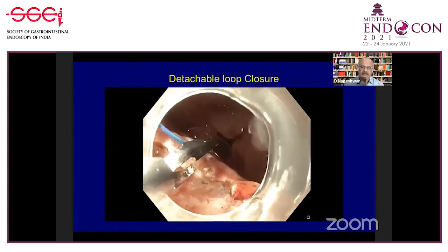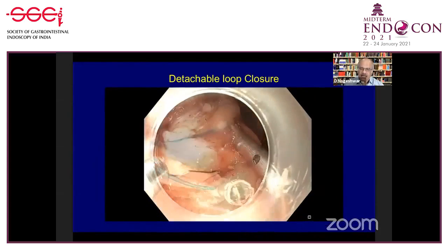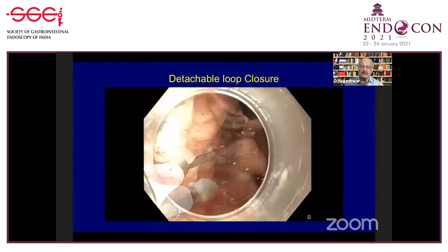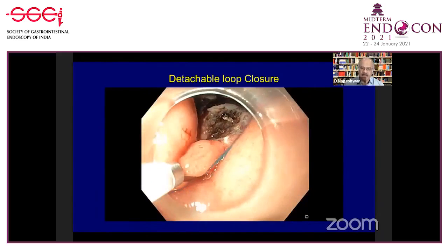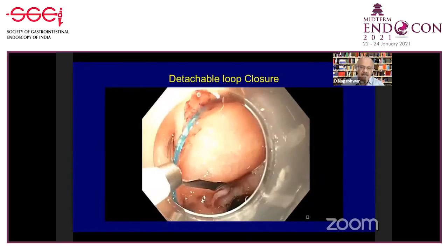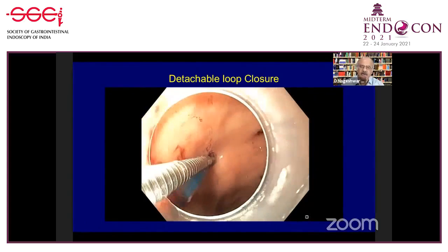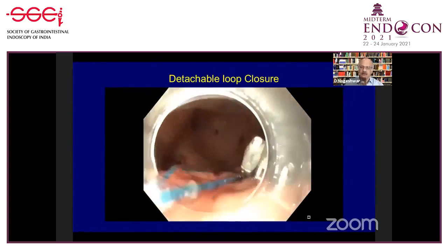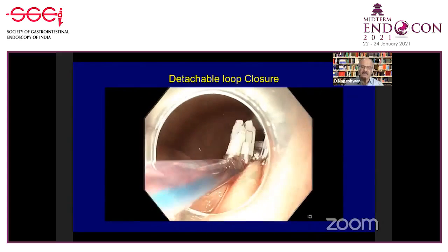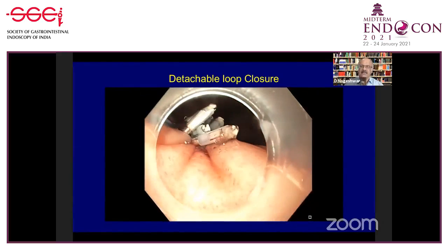And we also have a detachable loop now. It's called the Loop 9. If you do a large opening or a perforation and you want to close it, there were difficulties earlier. But this Loop 9 is a detachable loop. You actually put it in the stomach. It gets detached in the stomach. And then around this loop, you can put your clips. And then afterwards, you can go in, catch hold of the loop and tighten it. So the detachable loop, I think, is another innovation, again, available commercially. Anybody who is doing therapeutic endoscopy with large resections should have a detachable loop in their department, because very large openings can be closed using this technique.